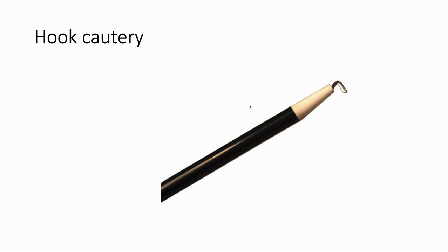This is the hook cautery — just like that Bovie cautery pen we saw before, but adapted for laparoscopic use. It's got a nice little curve of metal where the heat is used, and it's used for dissection along with electric cautery, frequently in laparoscopic cholecystectomy or laparoscopic appendectomy cases.